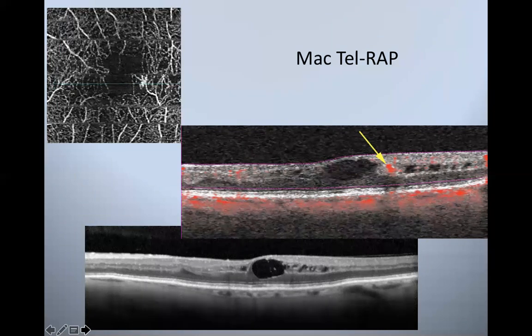And the new blood vessel will dive down through the intraretinal tissue down to the subretinal space and feed into a neovascular complex. So it's a little bit of a different animal. And it's very easy to identify in OCT-A. This top left image is an OCT angiogram, and you can see this very odd looking vessel pattern here, but follow the vessel along towards the fovea and you'll see it makes a quick turn and dives down. Vessels don't do that normally.